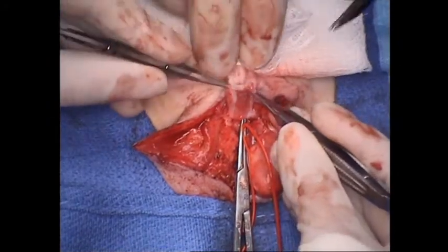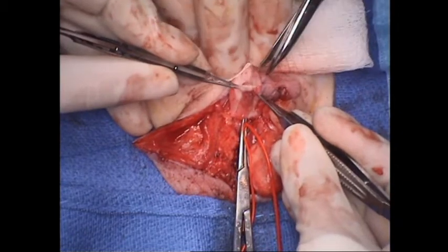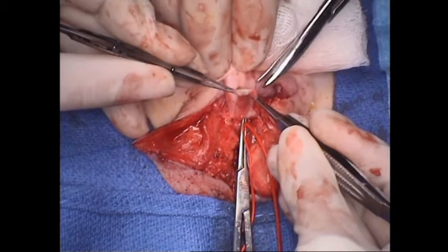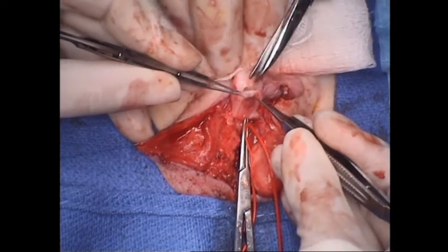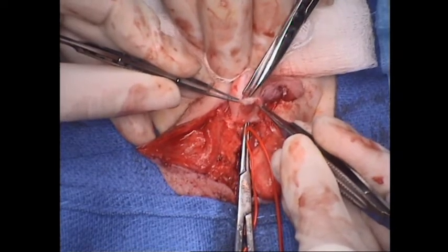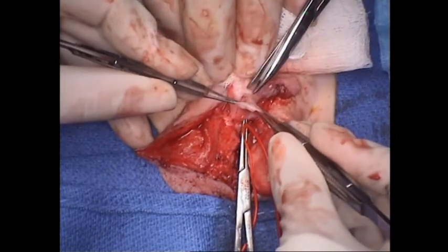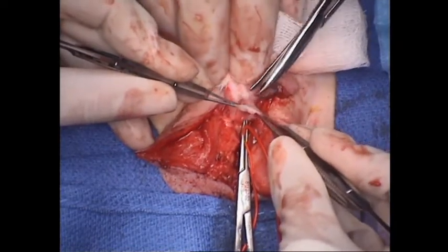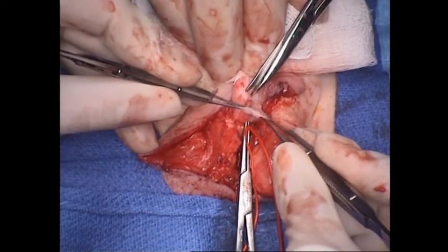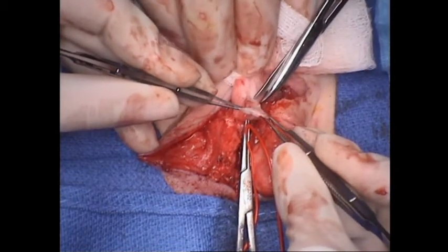But you're going to see how we cannot assume that that was all of the bending, and we're going to have to come back and repeat an artificial erection once we finish this dissection of the urethra and native urethral plate. And so just like we did anteriorly to remove it from the skin, we're going to do a similar dissection here, removing the native urethra and urethral plate from the underlying corpora, again, to gain length on our urethra to minimize the amount of graft that we have.